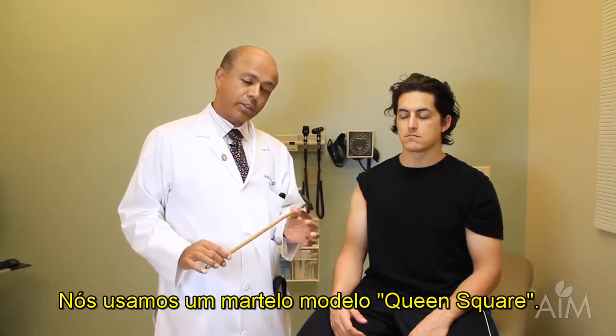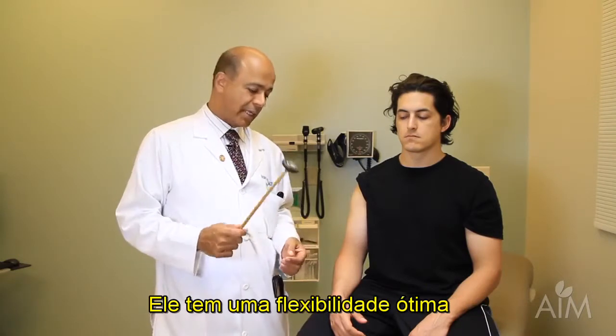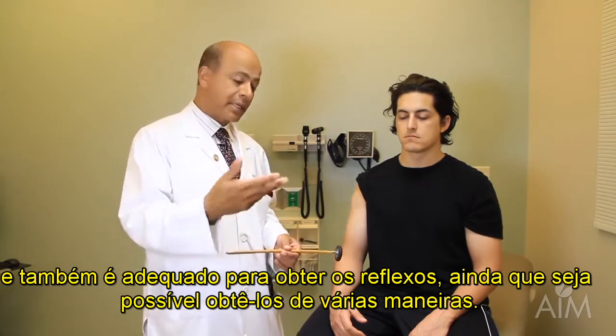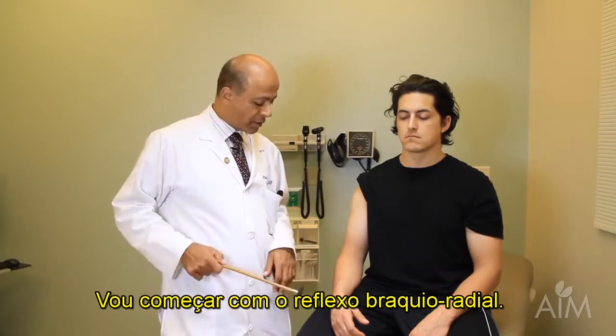We use a Queen's square hammer. We give this to all our incoming interns. I think it has a nice flex to it and is really a good tool to get the reflex, even though you can get it in other ways. We recommend this. I'm going to begin with the brachioradialis reflex.